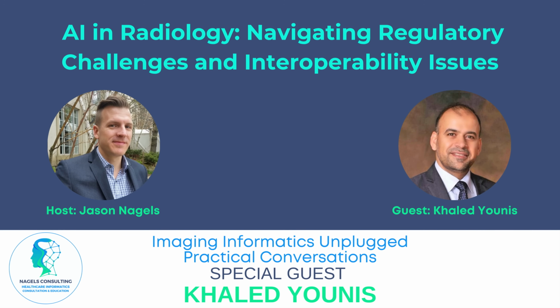It decides which feature to look at and which feature to ignore. And that basically rendered all of the research in feature extraction useless, or not very relevant. Still, you have to think about the complementary aspects between deep learning and feature extraction. So in addition to the image, you can also provide the features as input to the data, and that has been shown to be really useful, because you have the insights from the radiologist.